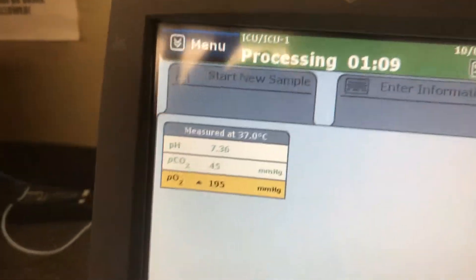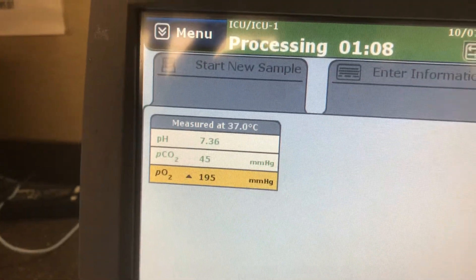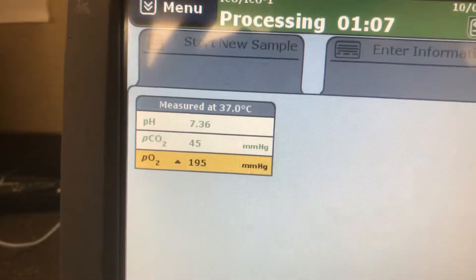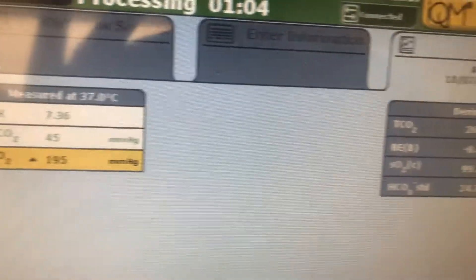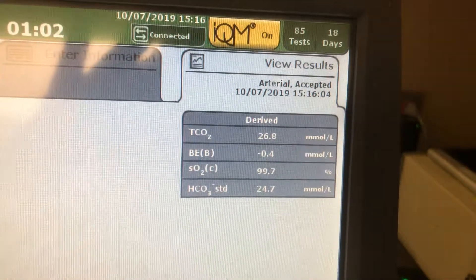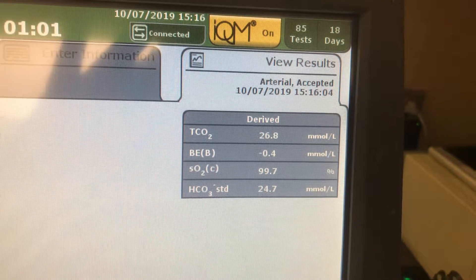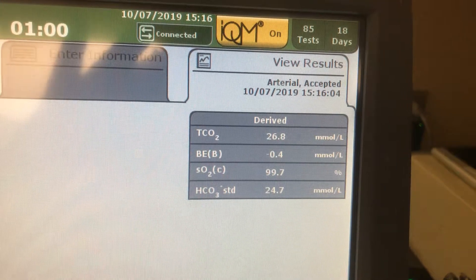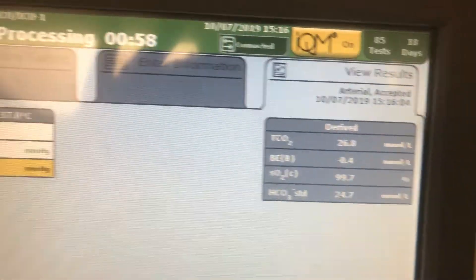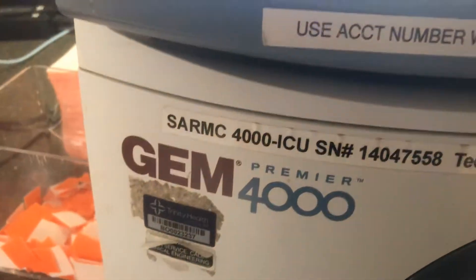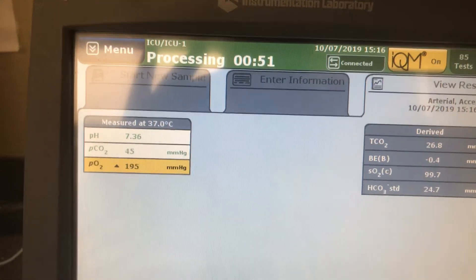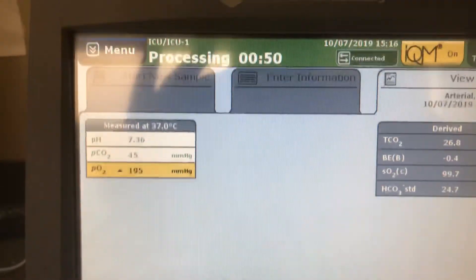We also have critical value reporting sheets that are available, but make sure those are reported per CAP requirements. Here's the rest of your ABG — when it comes to your SPO2 and your bicarb. And that is it — that's the GM4000 and how you run a sample here at St. Alphonsus. Thanks and have a great day!